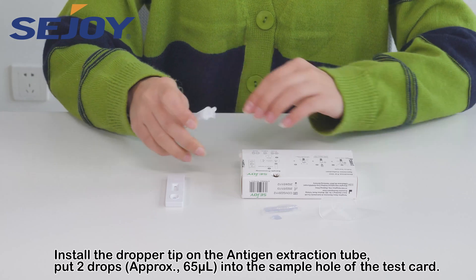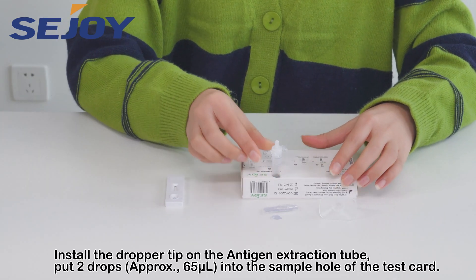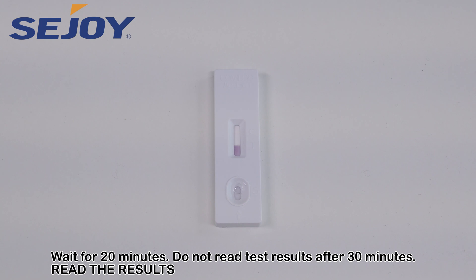Put two drops into the sample hole of the test card. Wait for 20 minutes. Do not read test results after 30 minutes.